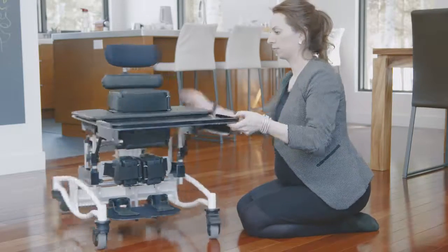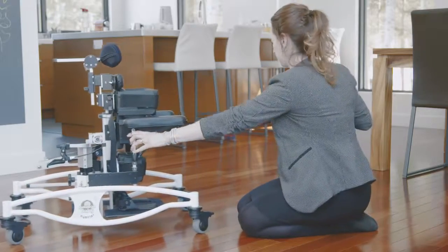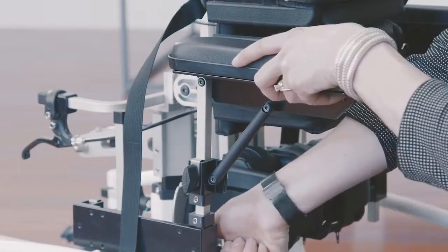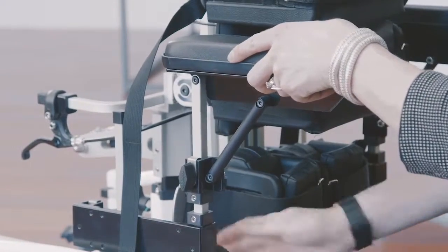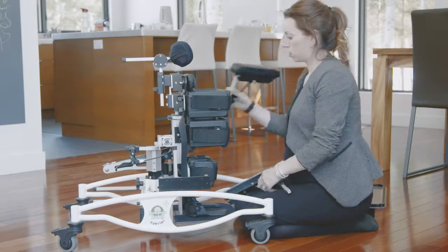First, undo the straps on either side of the tray. Remove the armrests from their original position and reinsert them into the opposite slot, which is the reverse position.